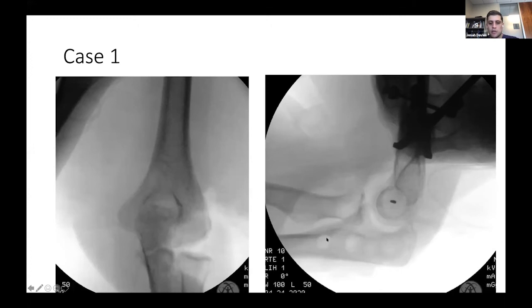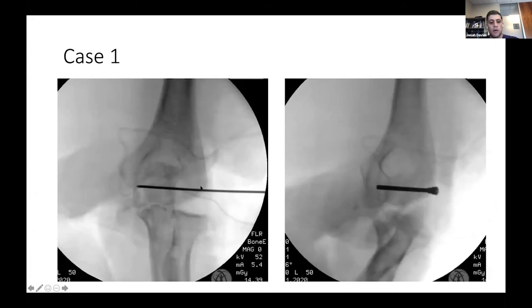You can see the drill holes for the bone tunnels, and I pass those through first. I get them all ready to go, and then I do the internal joint stabilizer. So here's the pin that's being placed, isometric point. You can see it's going from the lateral side through the flexion extension axis, going directly to where the medial MCL insertion is. And there's a guide to do this to make sure that you're nicely centered on the trochlea. And I usually use the lateral guide and perfect lateral fluoroscopy to get the pin. Then you drill it and place a pin through there.